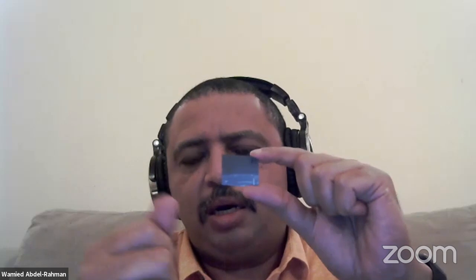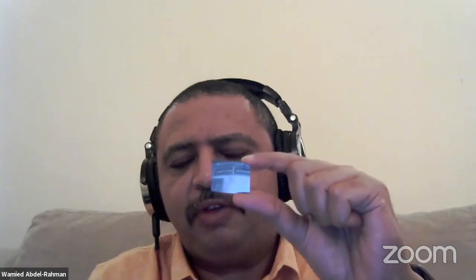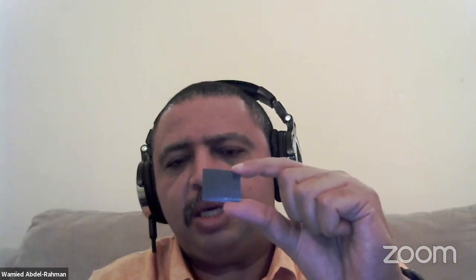That's for TBI dosimetry. Remember, these are going to be placed in contact with the patient, so I don't want the oil from the skin to affect the film. So we put them in a piece of paper, and then we wrap it with tape so the paper does not open. And we give it to our therapist. They know the positions, they put those films.